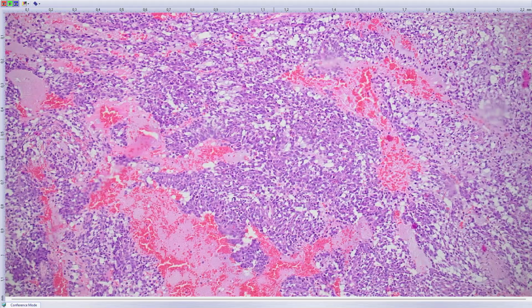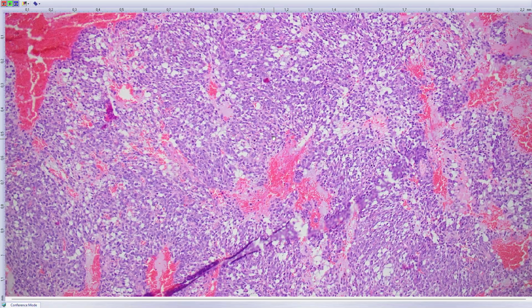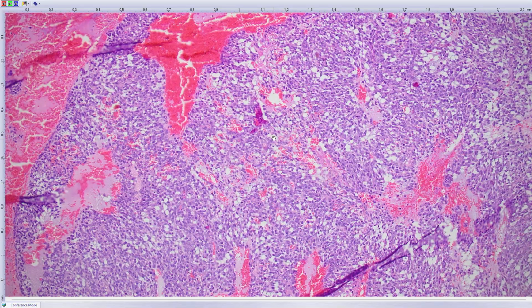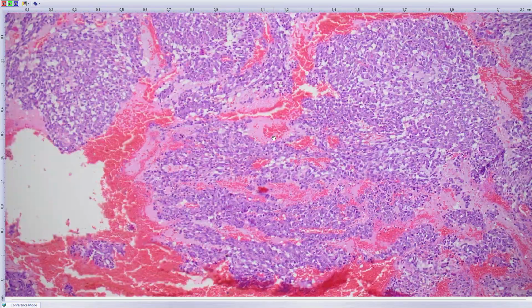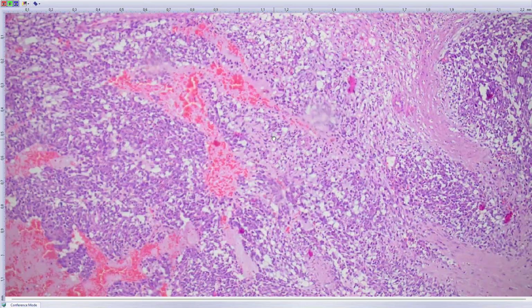These two markers tend to be positive, both of them, in CIC sarcomas, which are basically the second most common round cell sarcomas after Ewing sarcoma. And this would actually fit very well for CIC-DUX4 sarcoma, or CIC sarcoma. So a monotonous round cell, aggressive looking neoplasm. So when they sent it, I was planning just to do DUX4 to confirm my impression.